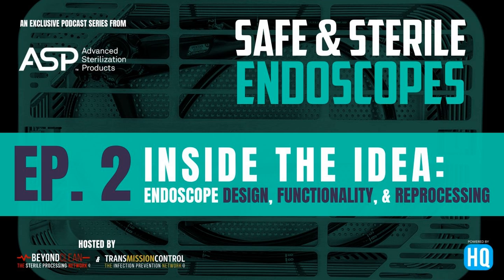And you hit the nail on the head. It's one more step in the complex procedure that we are making changes to. And when you think about diagnostic versus therapeutic, we have different scopes for that. We have a diagnostic scope, a therapeutic scope, and those channels are different sizes. We don't need large working channels when we're just going in to look for diagnostic opportunities. But when we move into therapeutic, where we're going to be doing interventions, we need larger, multiple working channels so that we can take care of that patient in whatever scenario it is in a faster way.